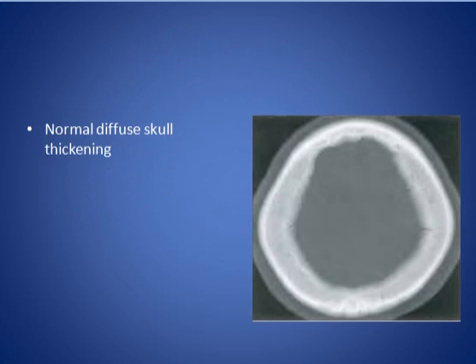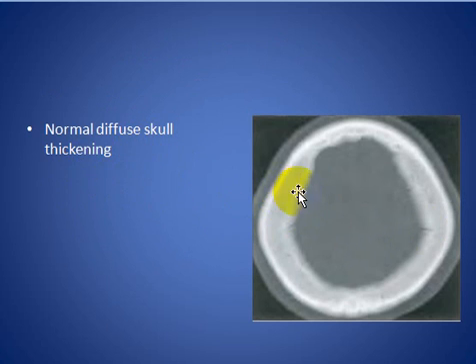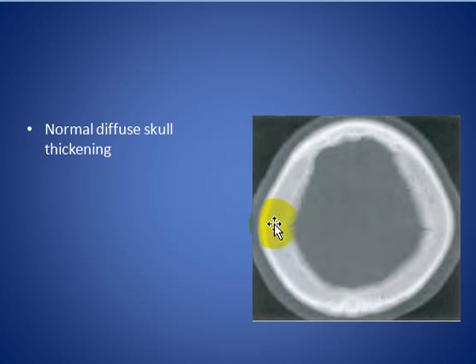This is the normal diffuse skull thickening. As you can see here, there is thickening and expansion of the diploic space, and this is a normal variant.